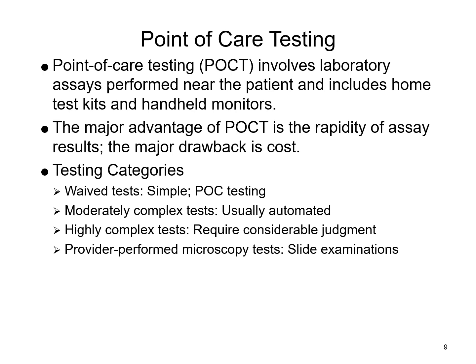Not to mention it's easier to throw a bunch of samples on a machine and walk away and forget it, versus actually sitting there doing the testing, setting the timer, reading the results, and recording those results. So if you're getting a larger volume, switching over to an automated method may be more cost effective.